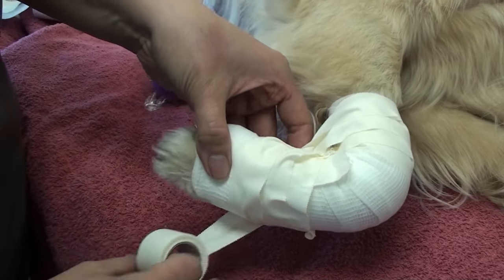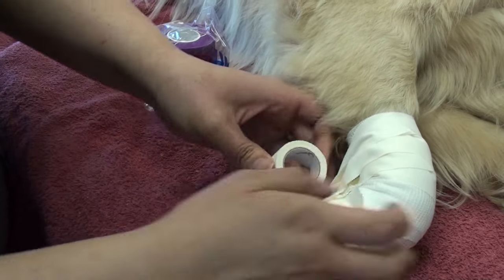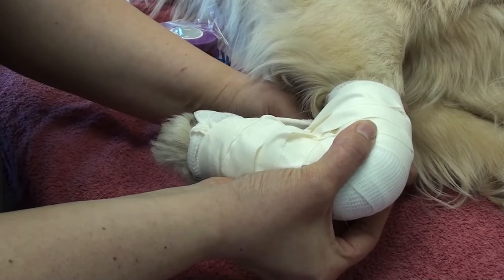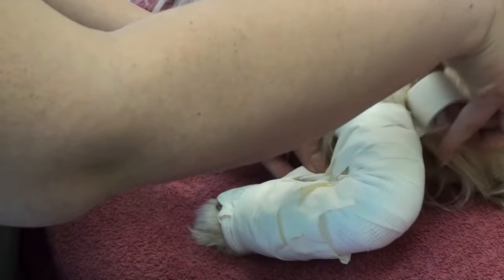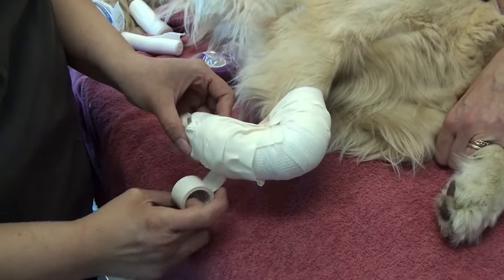So we have that fanning motion. What this does, in this larger dog, is allows the pressure to be a little bit better distributed over the radius and the metacarpals.